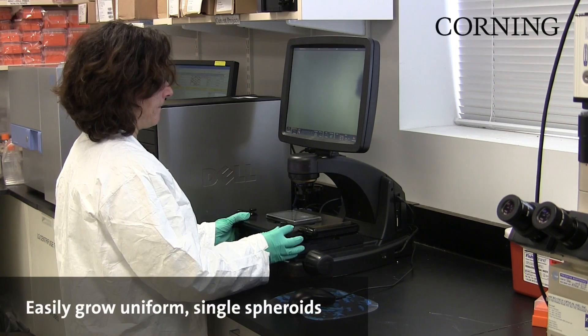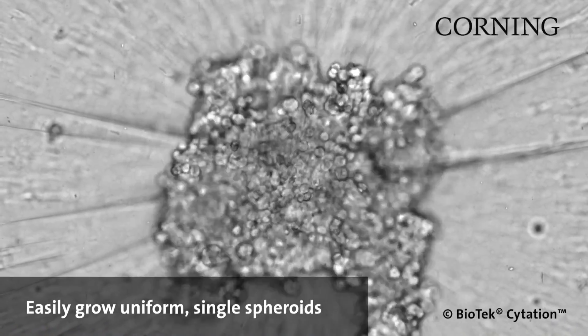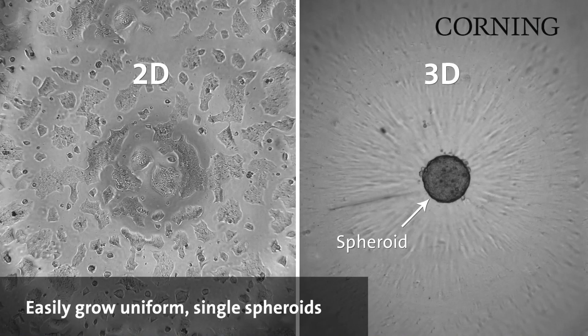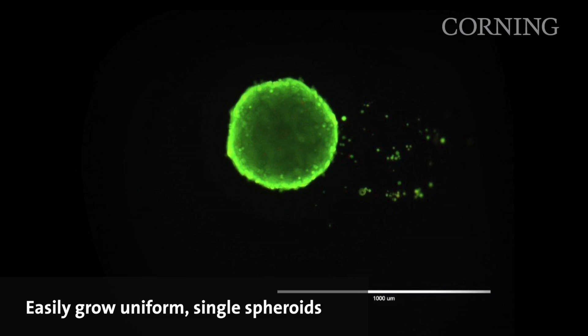The novel well geometry of the microplate aids in the formation of a single spheroid in the center of each well. Each plate features Corning ultra-low attachment surface, a hydrophilic non-ionic coating which prevents cells from attaching to the surface.